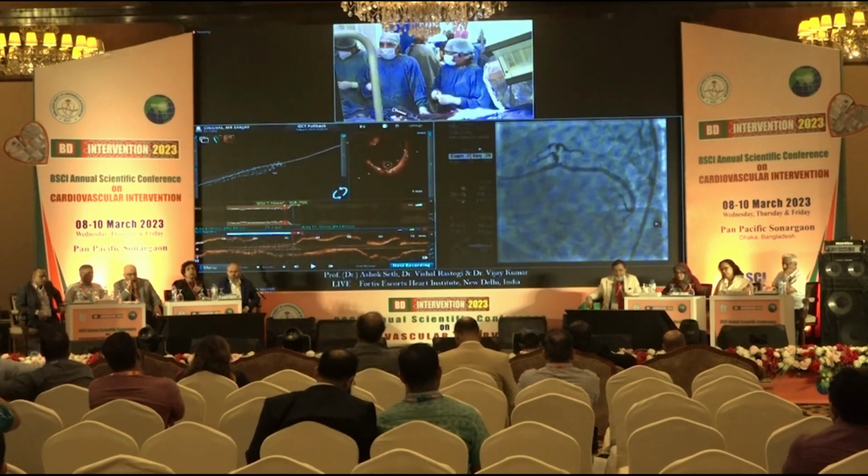So Nishit, what was the stent area at the tightest point? The stent MSA at that area is 5.18. That's about, compared to the distal where we got 6.5. That's why Nishit said it was a 79% expansion. Yes, we could do higher pressures there, and that's about it.